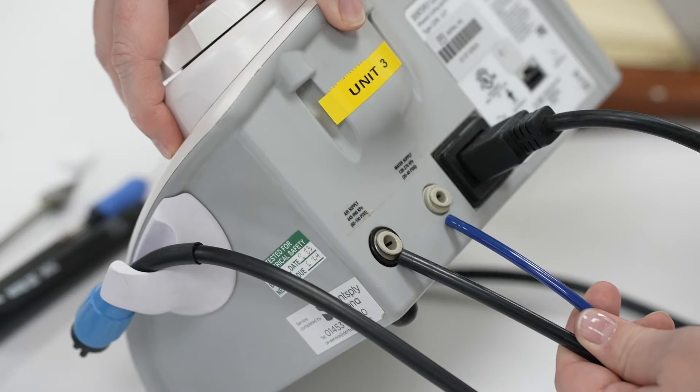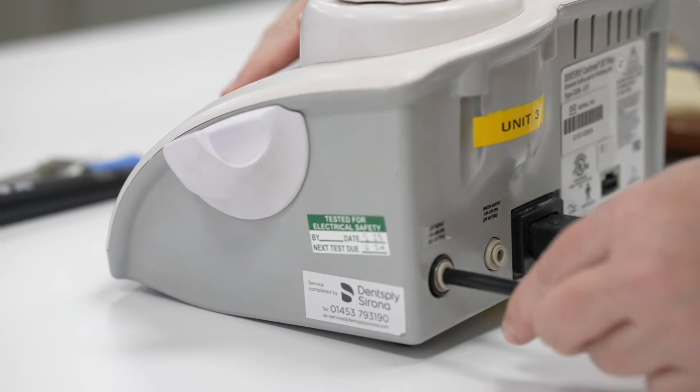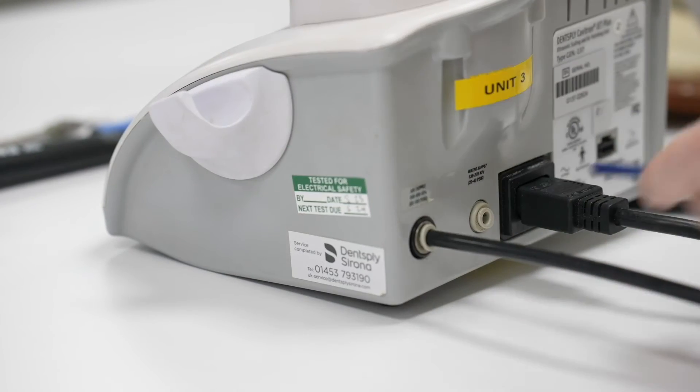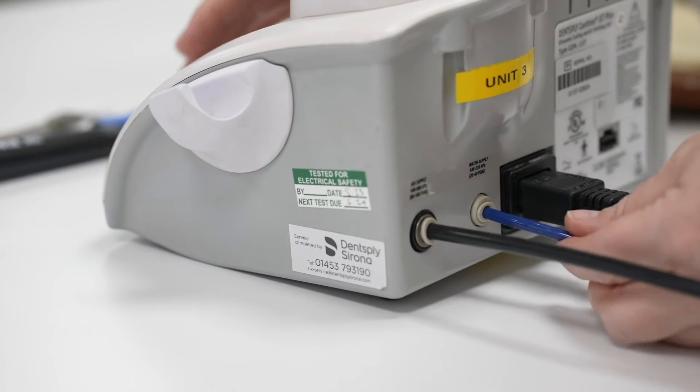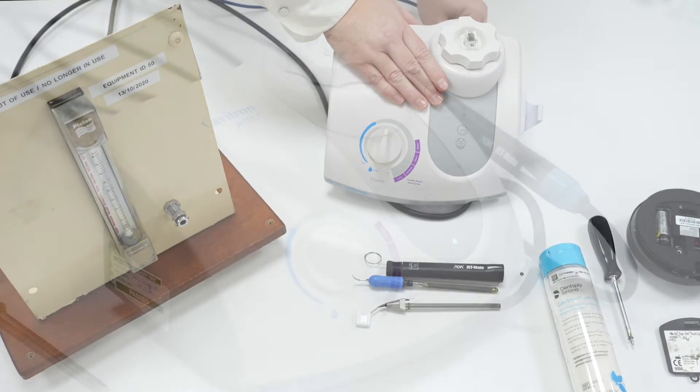Insert them both into the back of the Cavitron. It is very important that the water line and the air line are not mixed up. If accidentally mixed up you'll flood the unit and void the warranty which will cost a few hundred pounds to repair.